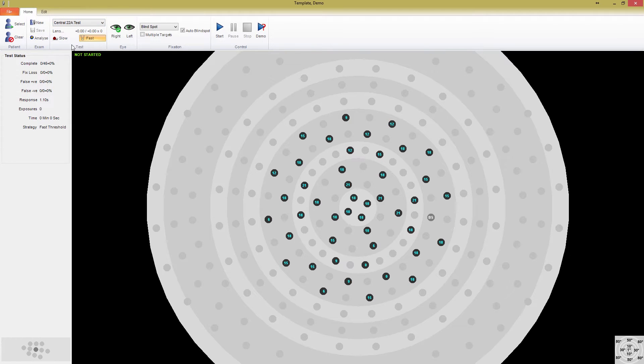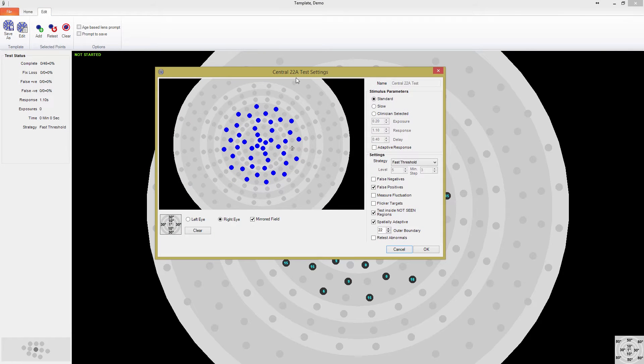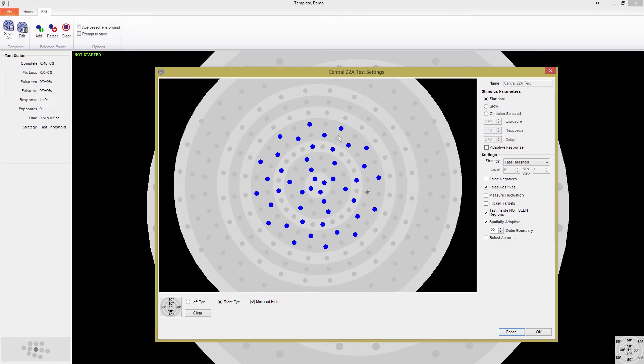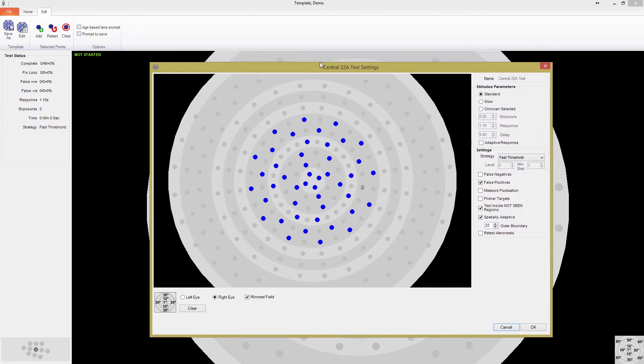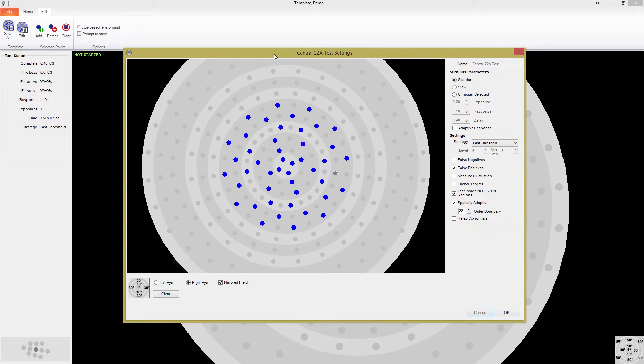Now, navigate to the Edit tab, select Edit Template, and the Template Editing window will open up. You can see that the name at the top of the window, as well as in the name bar, is named after the template that you've based the test on. Once we save our new template, this name will change.